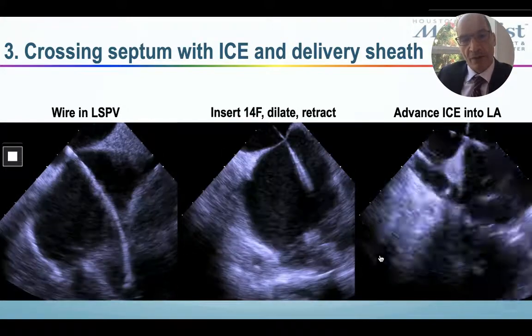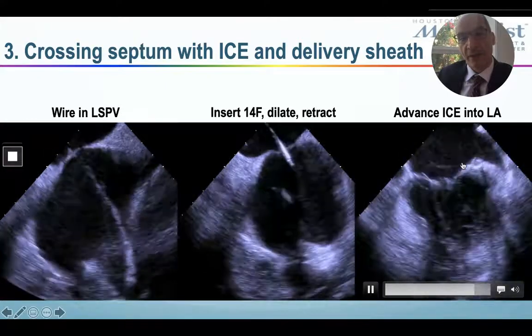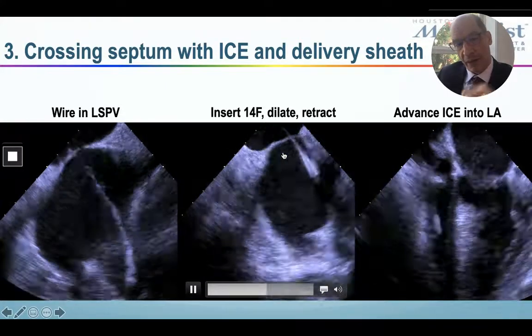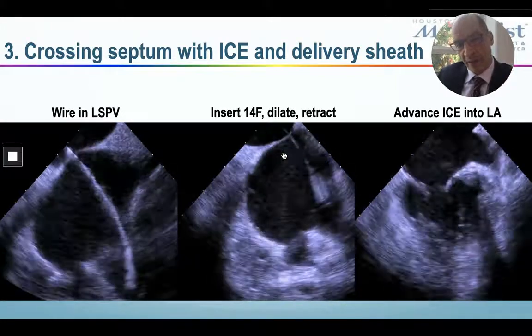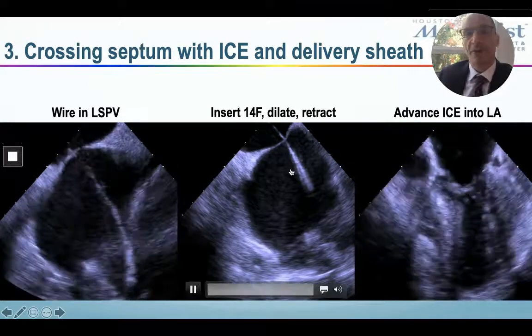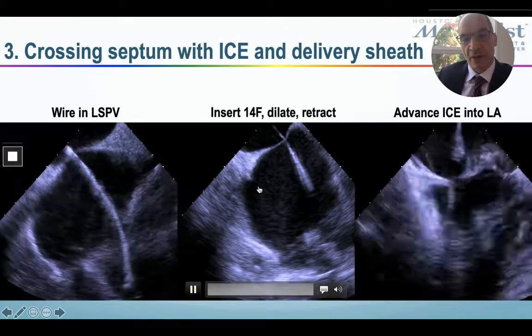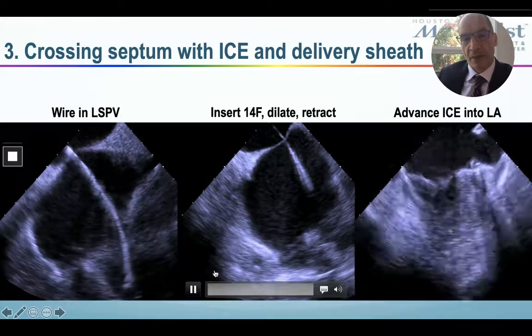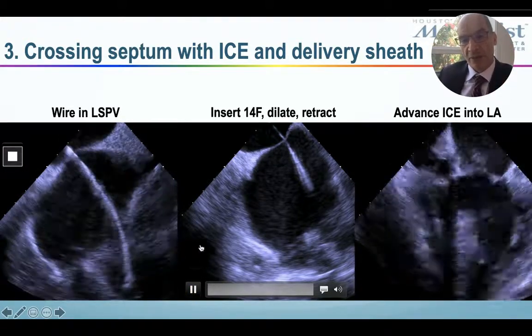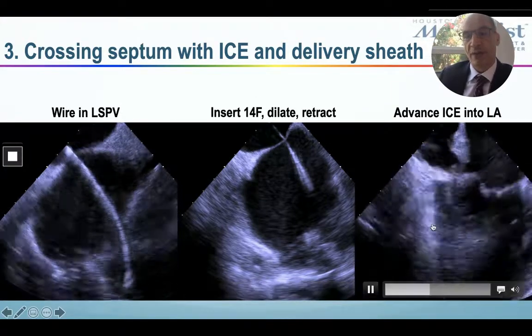You want to have the wire in the left superior pulmonary vein. And then you change whichever sheath you use to cross. You have to take it out, put a stiff wire in the left superior pulmonary vein, and then advance the 14 French sheath for Watchman delivery. I like to dilate the fossa ovalis several times with the 14 French sheath so that the puncture gets stretched, because it'll have to fit both the 14 French sheath as well as the ICE catheter.